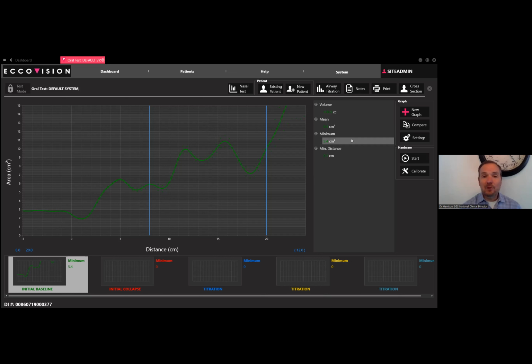Most of them came to your practice not for airway. If you're a normal dentist, if you're an airway dentist, then yeah, they're there for it. And that comes back to, don't get into the rabbit hole of having the conversation in hygiene when the patient's not ready to talk about it, because they won't hear anything. You're just going to waste your words. Absolutely. So set them up to come back for an airway consultation. Do what they're there to do that day, and then plant the seed.